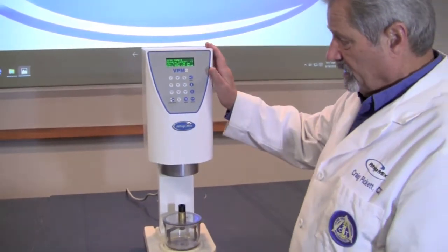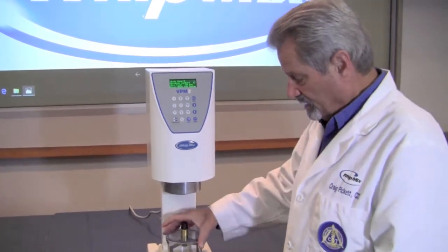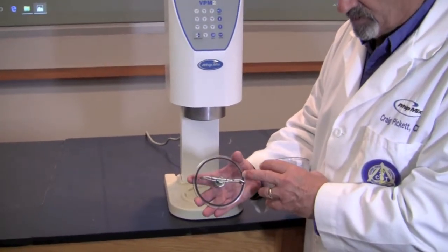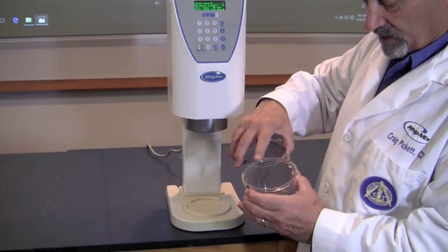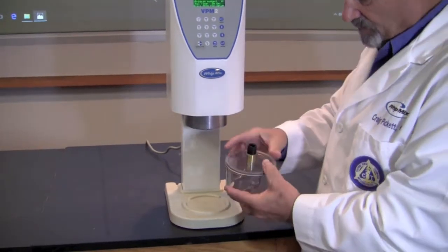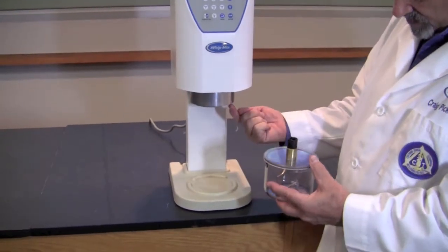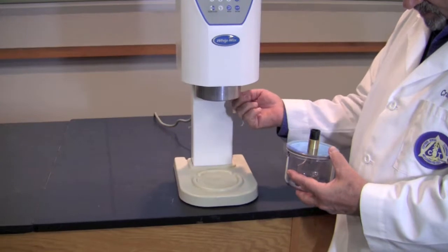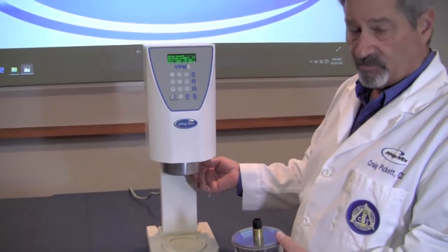In all maintenance, the first thing we want to do is make sure everything is clean. That means the seal on your bowl is clean and free from gypsum or investment. The top edge of your bowl is clean and free from gypsum or investment, allowing that seal to seal. Remember that the vacuum in this machine is pulling against this lid. There's also a seal underneath the throat of the machine right here — a large rubber o-ring — and it needs to be clean and free from gypsum or investment.